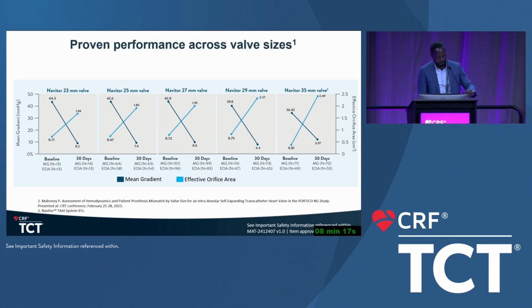Azeem, one thing you did not mention was risk of pacemaker. Do you guys think about that? I think in the past we used to think that maybe one platform is a higher risk, and I don't think we think that anymore. You know, this patient, right bundle branch, left anterior fascicular block, high risk for pacemaker, regardless of which system.